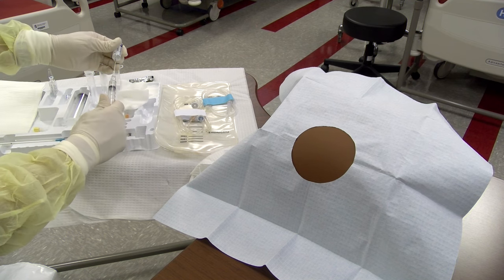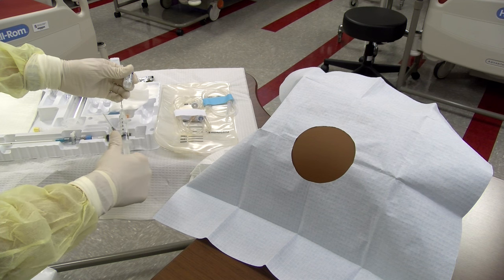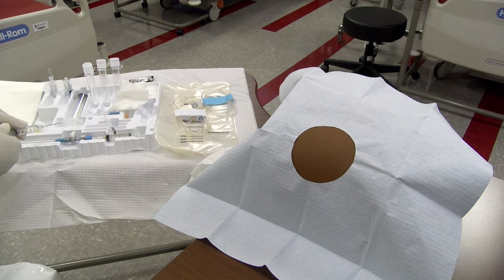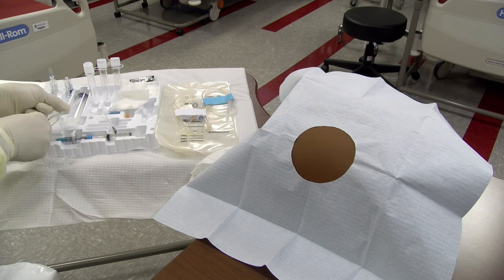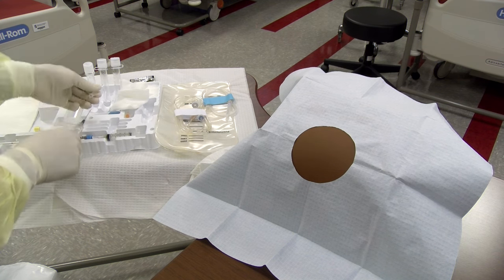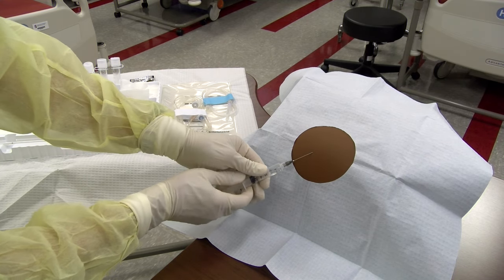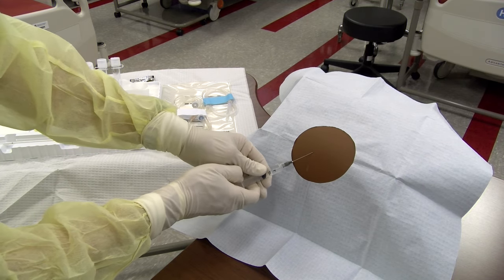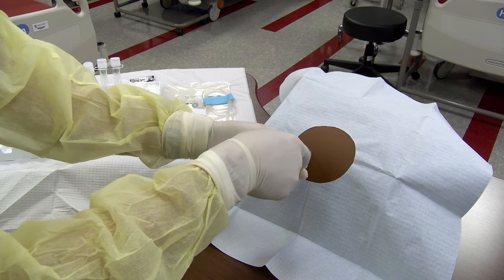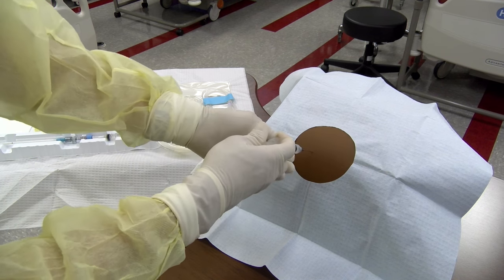Draw up lidocaine from the vial using a filter or other large gauge needle into a 10 cc syringe. Place the 27-gauge needle onto the syringe and inject a wheal of lidocaine at the selected site. Puncture through the center of the wheal and aspirate as the needle is advanced to ensure no vasculature is penetrated. Stop when ascites fluid is returned and inject lidocaine along the entire tract as the needle is withdrawn.